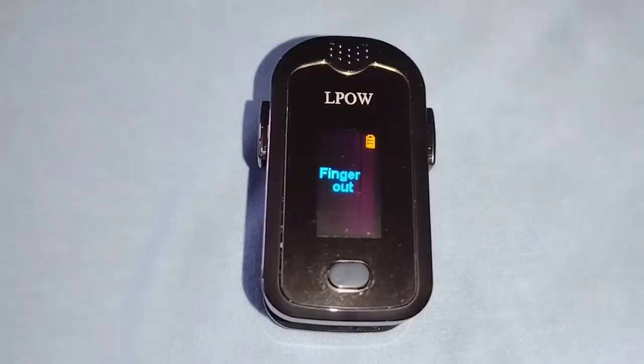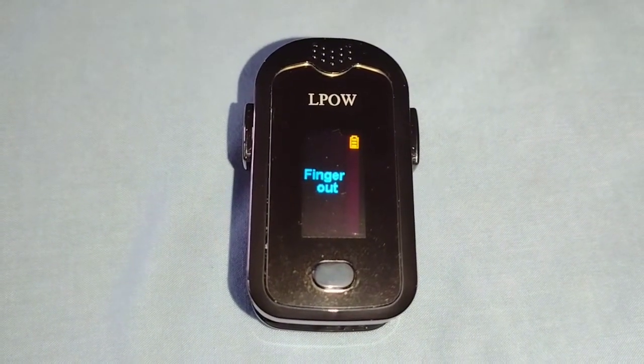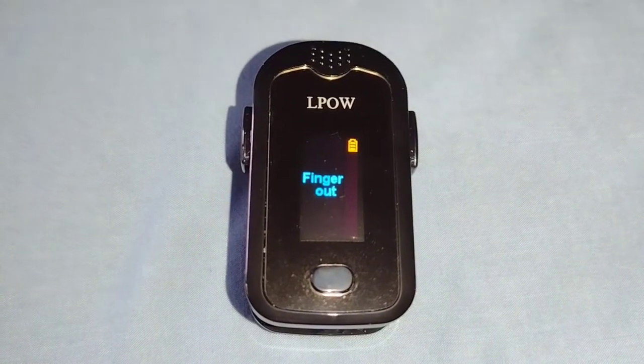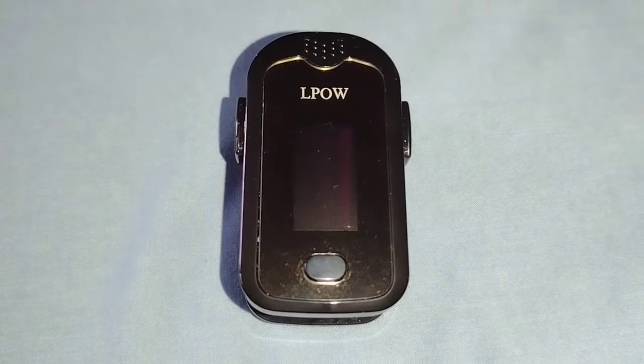One more note about the oximeter: it has an automatic shutoff feature. When you take your finger out, as it shows right there, it automatically turns off just like that.